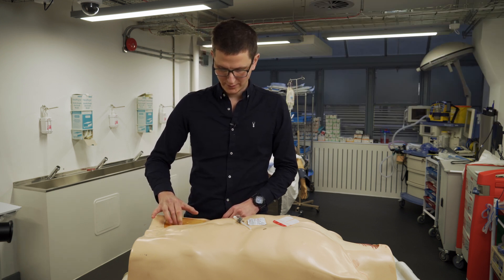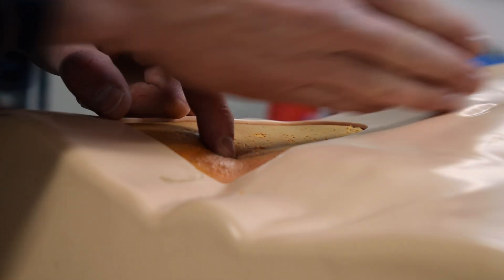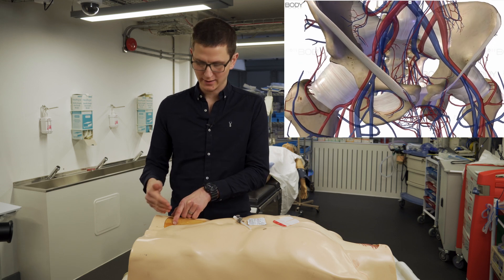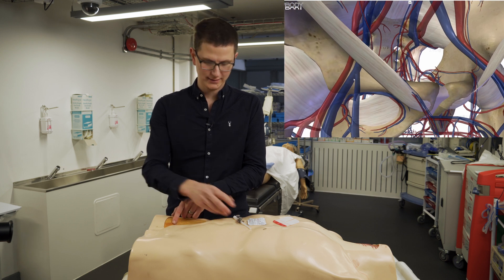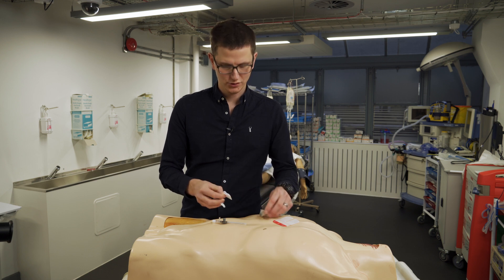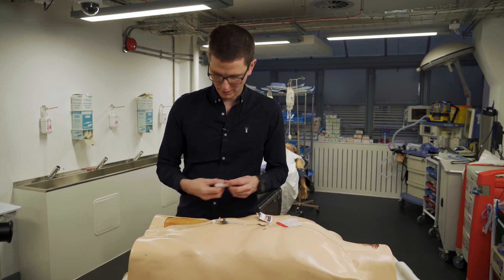We're going to aim at the umbilicus. If we take a look at the anatomy, you can see how if we went at that angle, we would catch the femoral vein — and that's exactly what we want to do. Obviously you're going to clean. This is best done with an ultrasound to confirm placement and to confirm location. If need be, that is a good option.